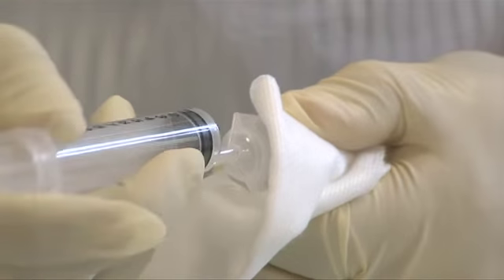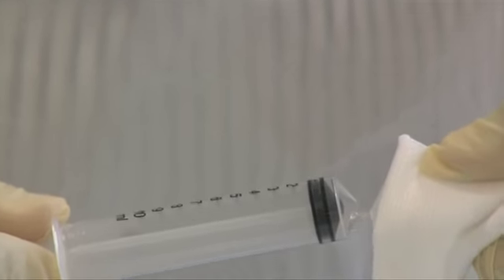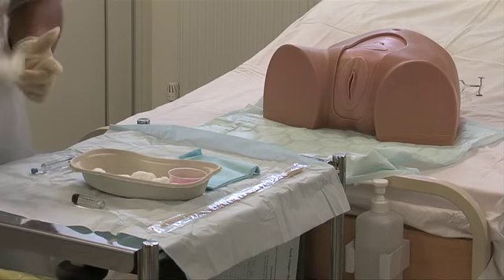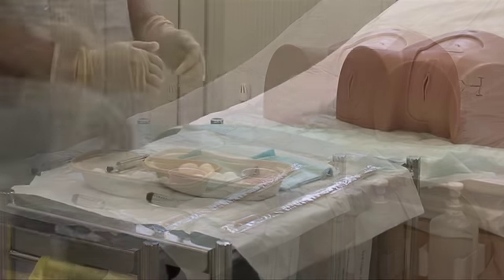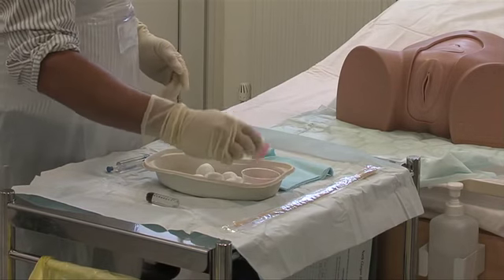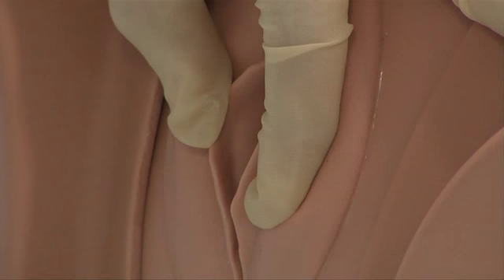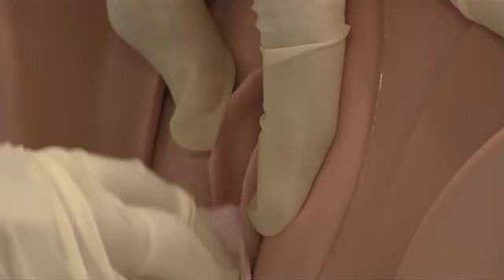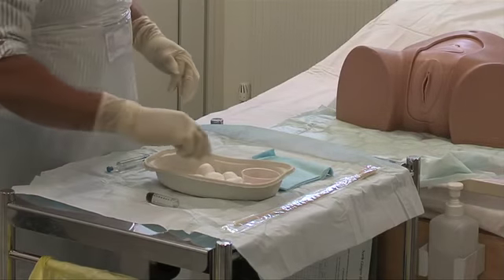Carefully draw up the sterile water into the syringe. Separate the labia minora with one hand to reveal the urethral meatus. Clean around the urethral orifice with an antiseptic solution using single downward strokes.